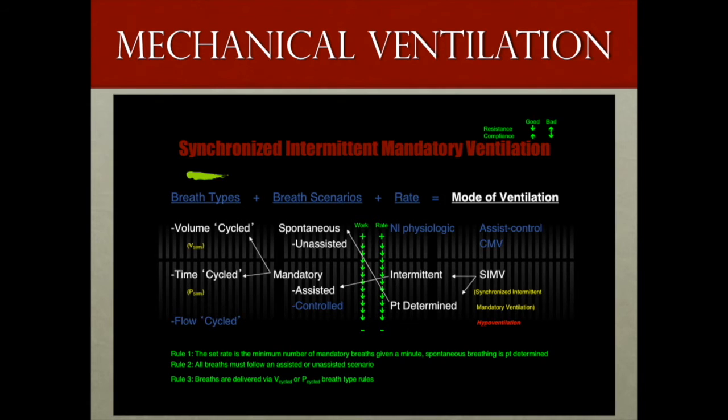And again, the characteristics of the mode is all in the name. The first rule is that the set rate, which is usually an intermittent rate, will be the number of mandatory breaths that is given. In between, the patient will have a patient-determined breath rate, meaning that they will set their own spontaneous breath rate.